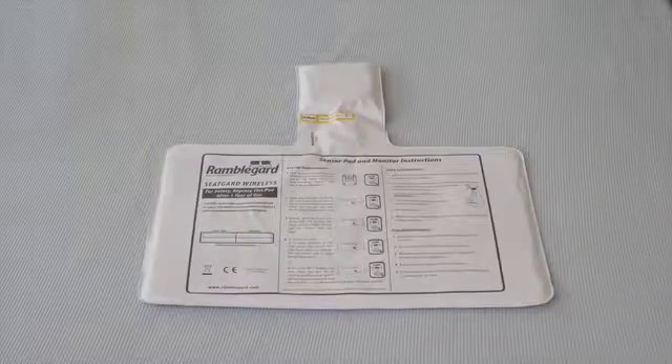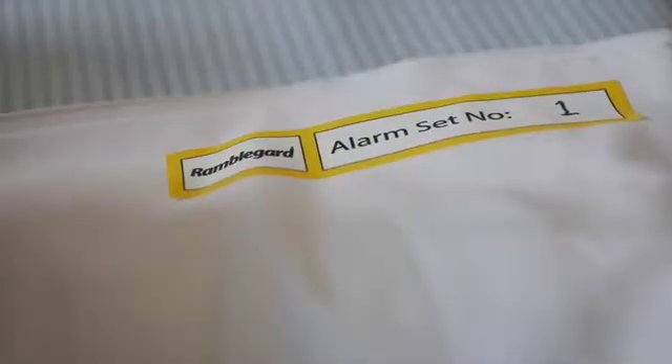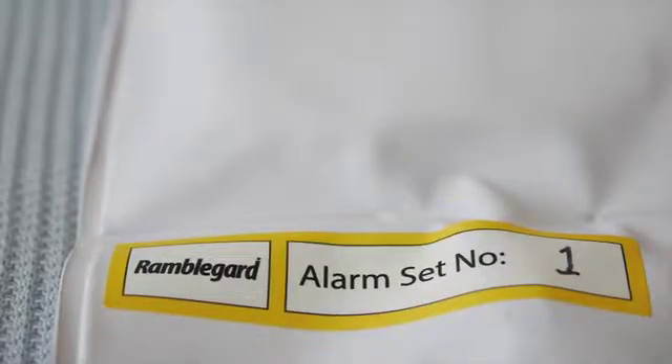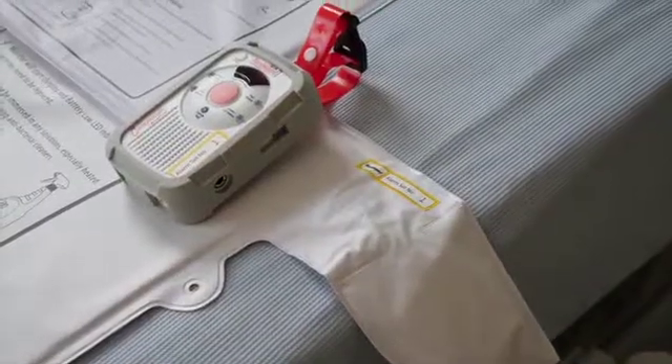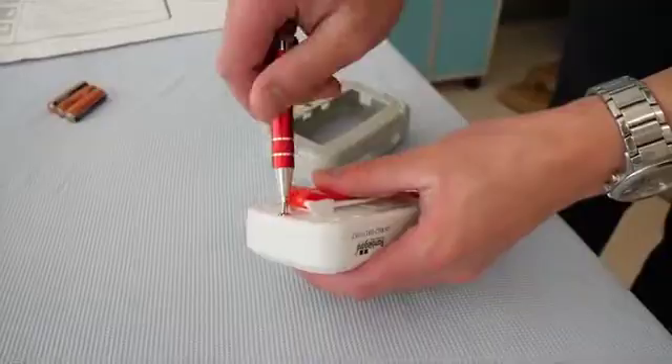And a wireless seat pad with transmitter, along with the required batteries. Please ensure that the set number on the bed pad, seat pad transmitters, and companion monitor match.